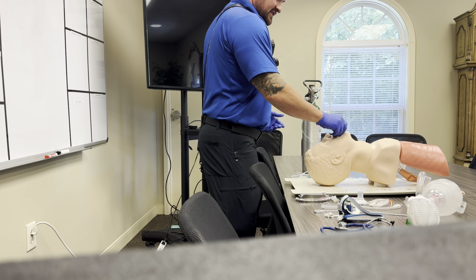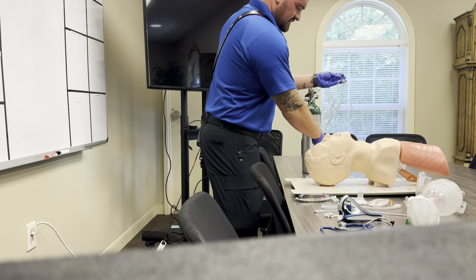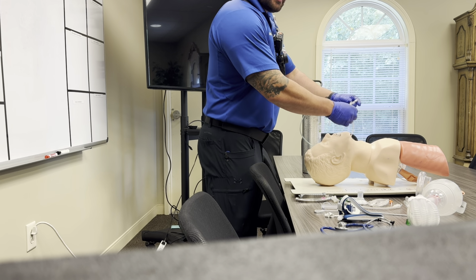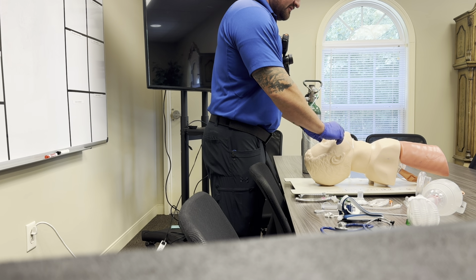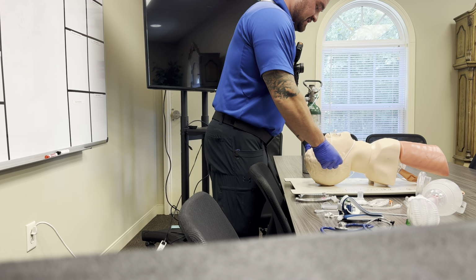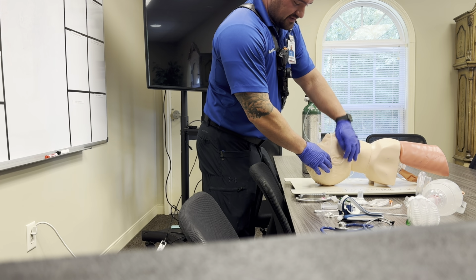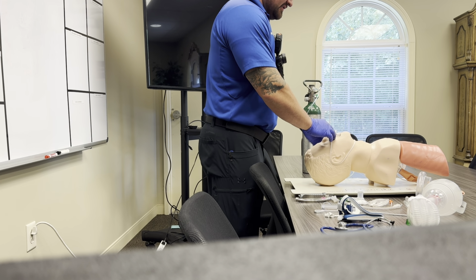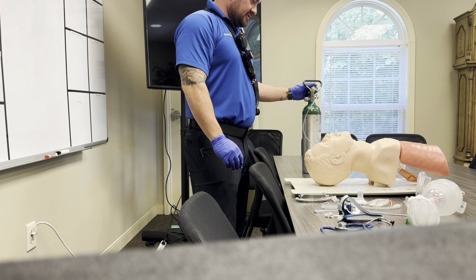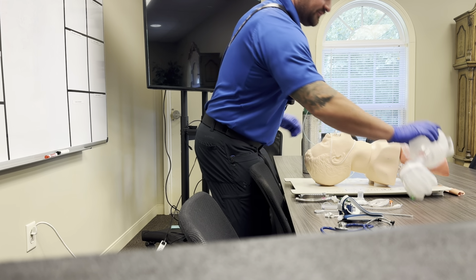Okay, so our OPA is in there, it's holding their tongue out of the way. Another thing that I like to do to help pre-oxygenate your patient, and if you do any type of critical care, flying, anything like that, this will pre-oxygenate your patient with a nasal cannula. In this particular case, this is a nasal cannula with the end-tidal CO2 detector, so you get both your end-tidal and oxygen delivery. So we're going to crank this oxygen all the way up. Okay, so that's going, we're pre-oxygenating our patient.